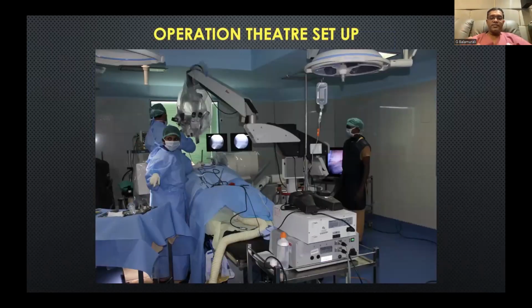The operation setup is very similar to any other way, but you need to make sure that your assistants and your team also look at the microscope, because you're already opening through a very small opening, and your assistant needs to see the screen on the TV.